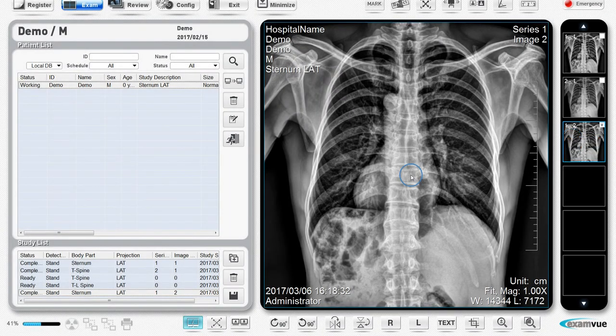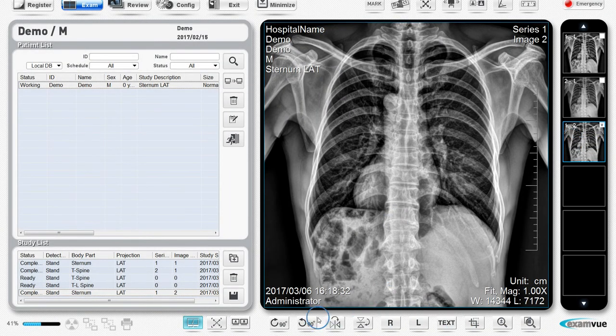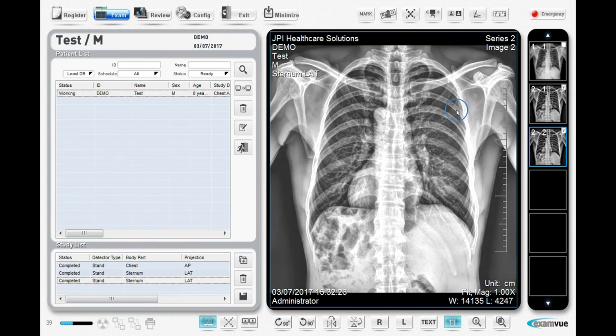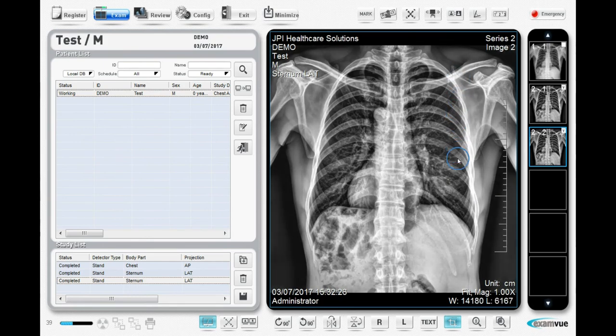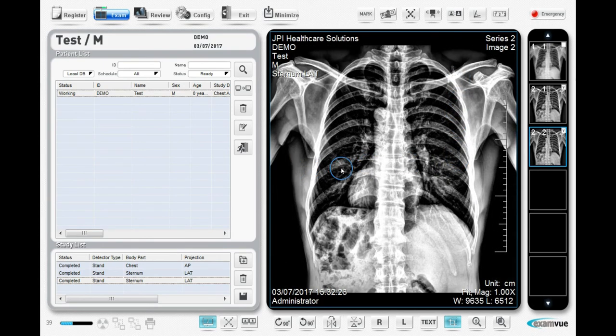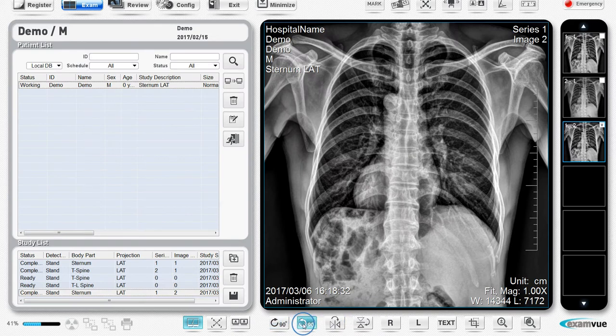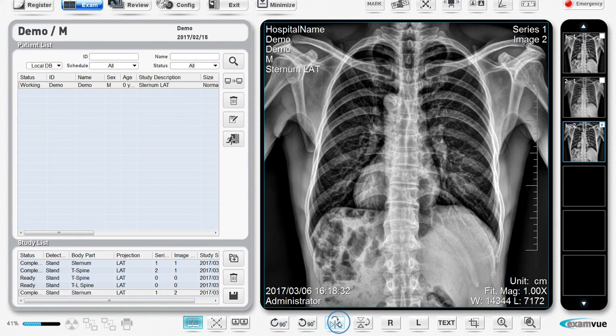After you have taken your x-ray, there are several things you can do with it. It can be lightened or darkened by holding down the left mouse button. You can rotate the image, flip it, add left or right markers, and add text annotations.